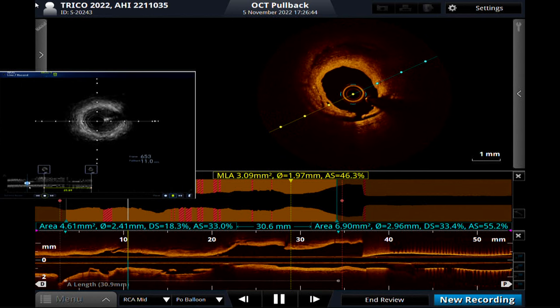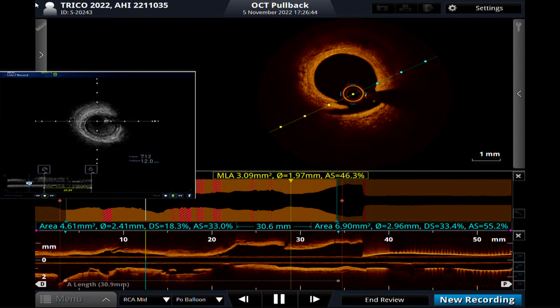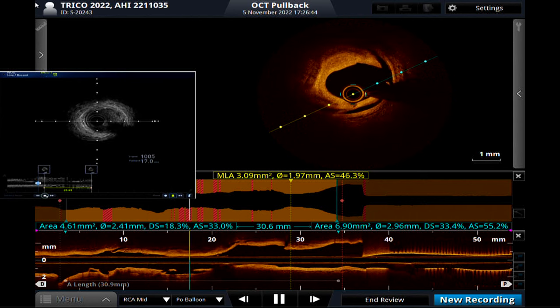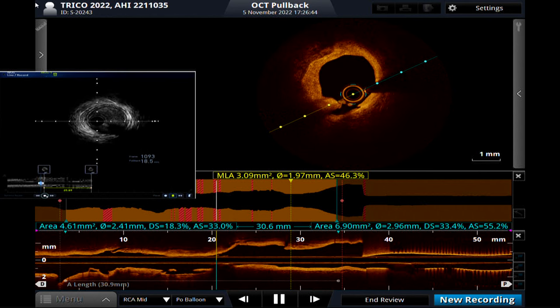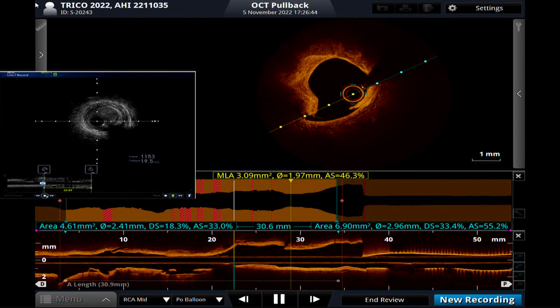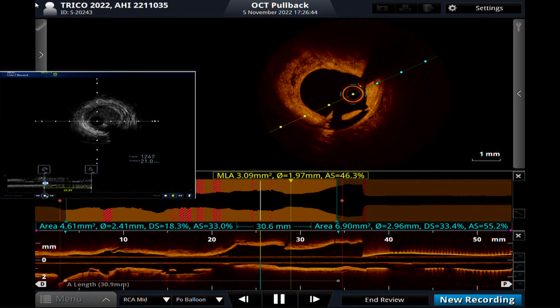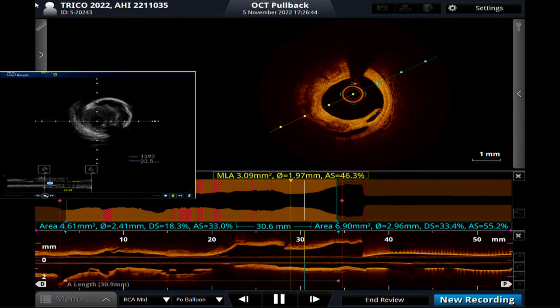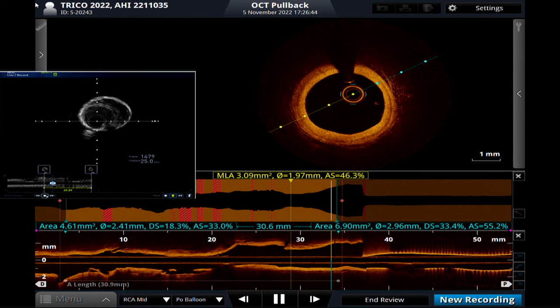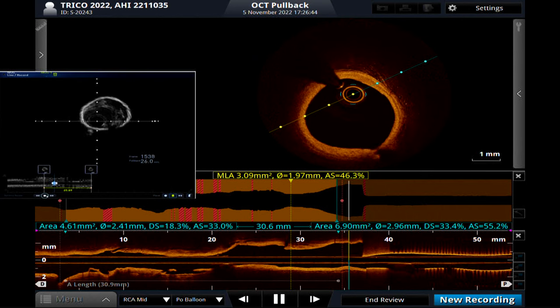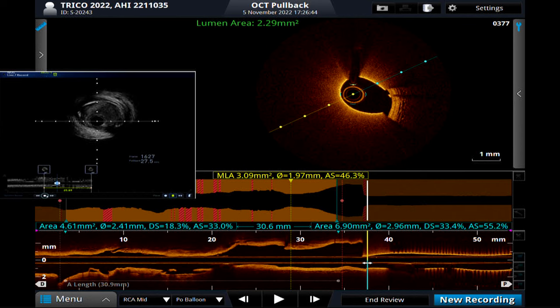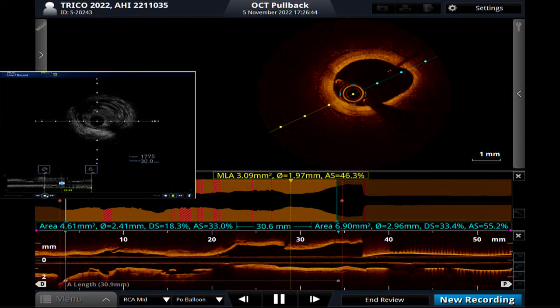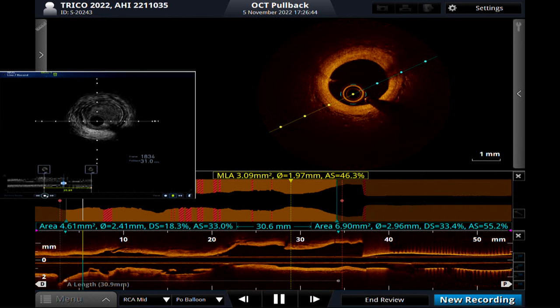Now the simultaneous pullback. We can identify the dissection clearly by OCT, but it might be difficult by IVUS. We can also identify calcium thickness by OCT, but it might be difficult to identify calcium thickness by IVUS. We can identify calcium by IVUS, but there are some differences. OCT provides much more detail and is easier to understand what really happened within the coronary artery.